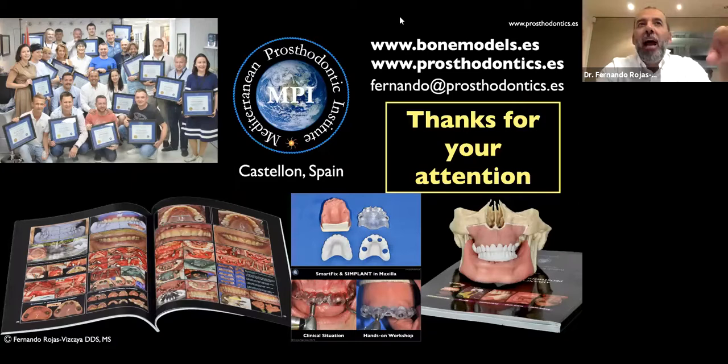Imagine that you are doing a mandibular or maxillary complete denture that you will convert into a fixed prosthesis with pink prosthetic area. Once you make the conversion prosthesis, or you make the pickup, that prosthesis is supported by soft tissue. So that prosthesis is keeping the space that you have at the beginning if you don't make bone reduction. If not, it's another topic, but normally, once you make the pickup and you cut the flange of the prosthesis and create the convex shape, you never touch what we call the PTJ, the prosthesis tissue junction, a small area that could be 1 or 2 millimeters that is flat all around.